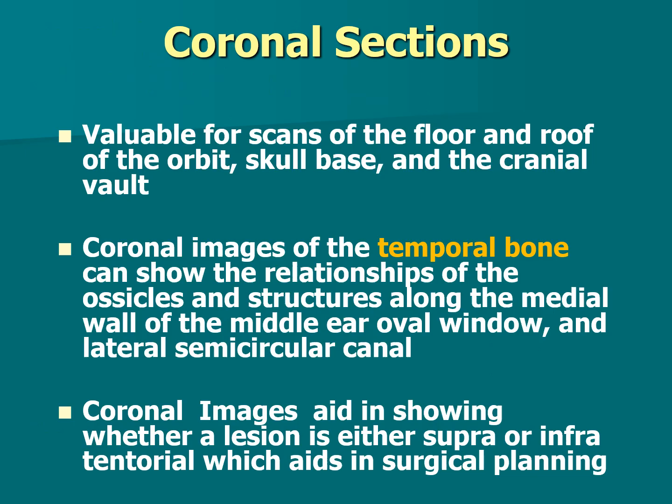That you're going to look at particularly. Coronal sections, again, this is a little bit old information because we are going to do reformations on all brain studies in the coronal plane, but it's valuable. The coronal plane can show us the roof of the orbit, the base of the skull, and the cranial vault. It lets us see the orbit outline better than axial studies, because when we're doing the axial studies, we're not seeing the whole orbit at one time.